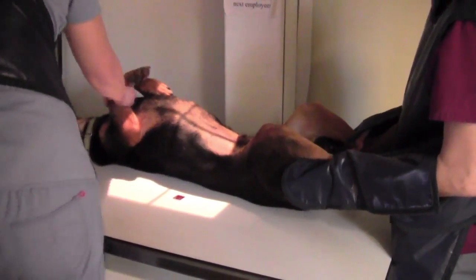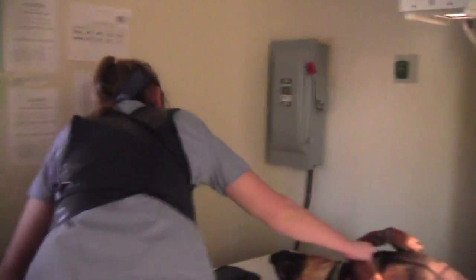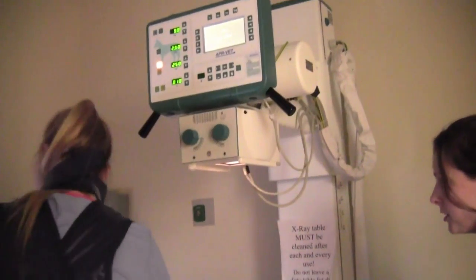In this case, we did not have sandbags to hold the hind limbs in natural position, so my assistant pulled the hind limbs caudally.